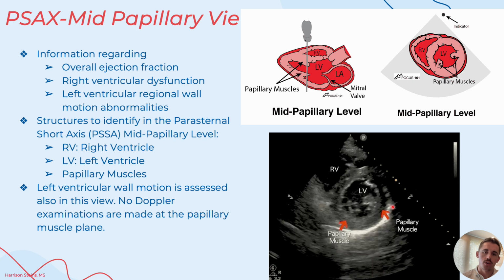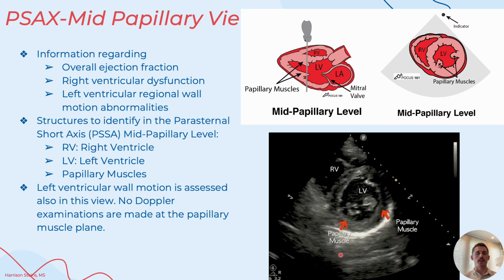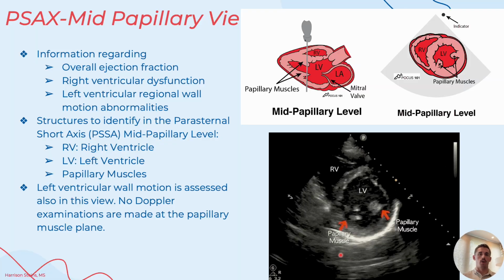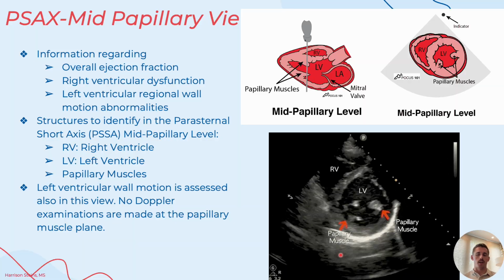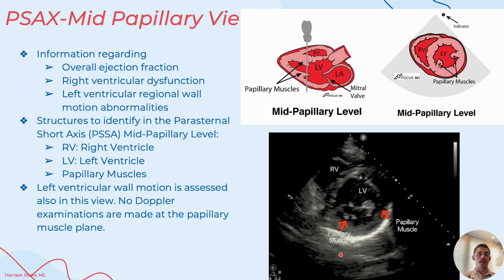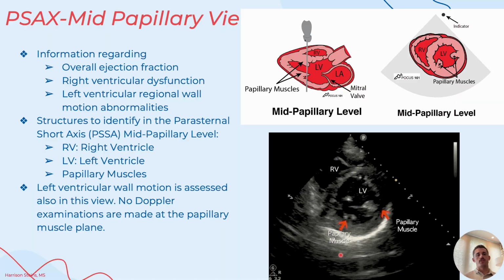of the left ventricle here, moving differently than the other parts of the left ventricle. And that's important because that could indicate ischemia or some other abnormality to one specific part of the heart. Think about looking at EKGs, which we'll talk about, and how those can correlate to what you're actually seeing on ultrasound. You can infarct one specific part of the heart while having normal function in the rest of it.